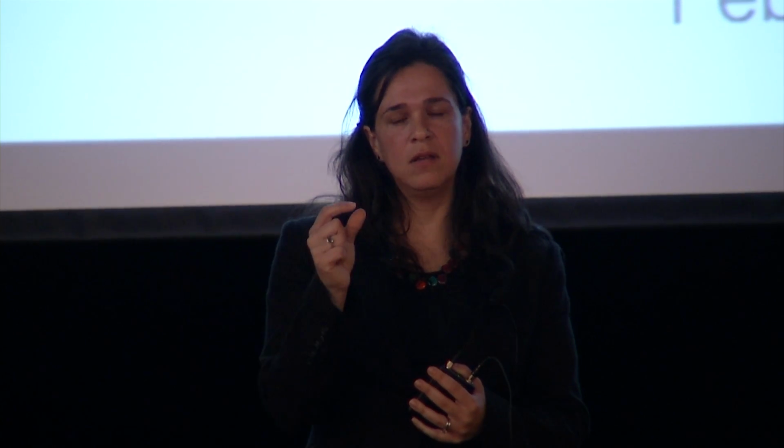You have to pick the application for which you are going to develop. So, for instance, the mapping of the blood oxygenation is very applicable for ulcers, bad ulcers, and things like that, that you really need to monitor and compare different parts of the body. Now, the tiny devices that are implantable and people swallow and so on, it's very hard to get the resolution with this technology. So I would stick to silicon in that case.